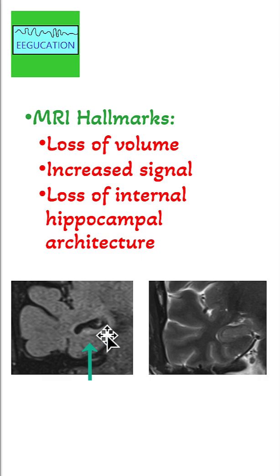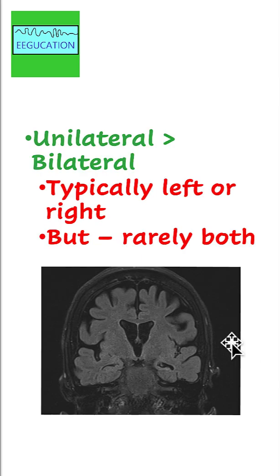So increased signal, loss of volume, loss of internal architecture — this is a normal hippocampus on the other image.